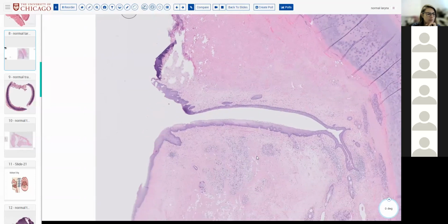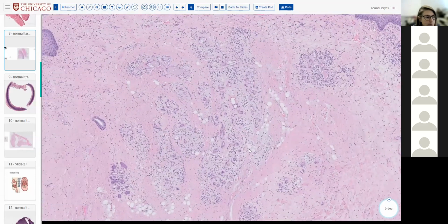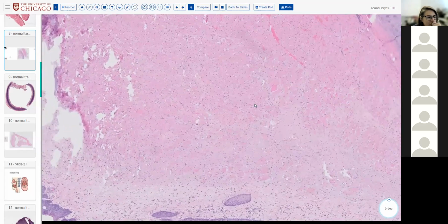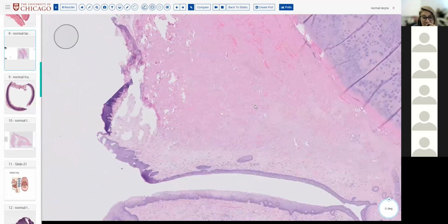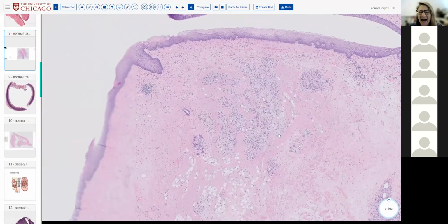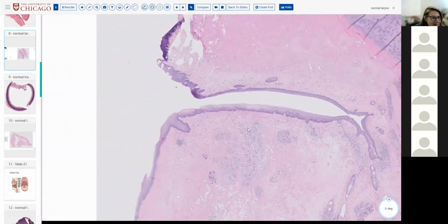It may or may not be anatomically relevant. Go ahead. I believe that the one that's on top is actually the true cord, and the one that's on the bottom, it looks stratified, maybe also squamous, and I would say that's the false vocal cord.